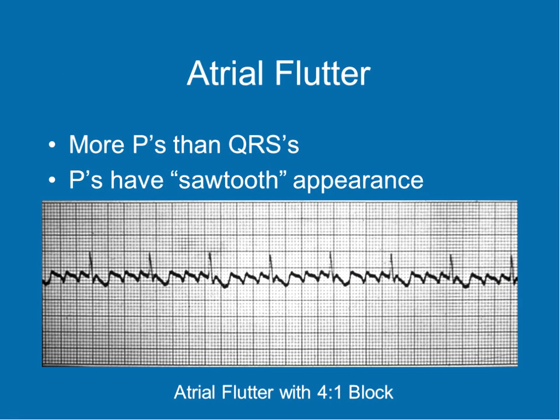Now, in this atrial flutter, you have a block. This is a 4-to-1 block. So you have the very normal sawtooth appearance. The atria are contracting, and there's a P wave buried in the T wave too. 1, 2, 3, and there's that fourth one there. So the ventricular rate is 5, 10, 15, 19. It's very close to 75. Divided by 19, yeah, 78. If it was exactly 20, that would be 75.